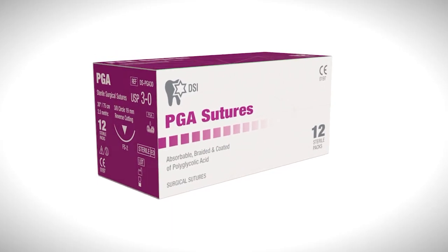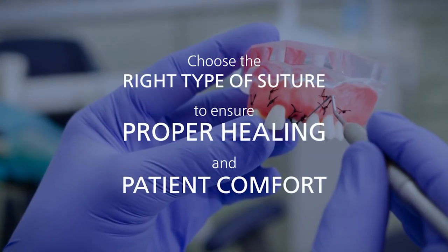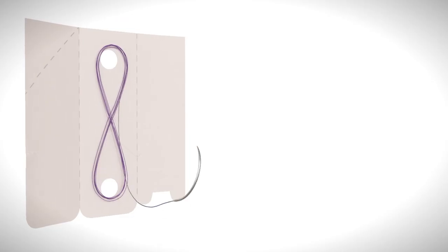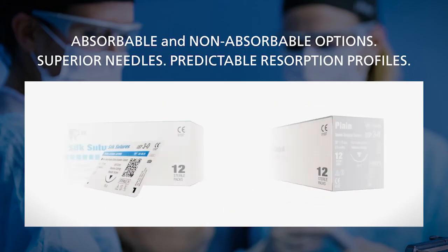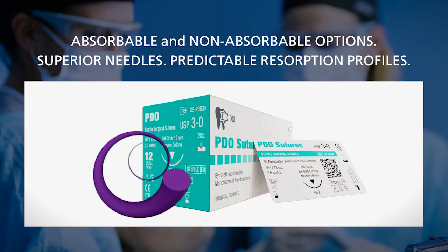In conclusion, choosing the right type of suture is crucial in ensuring proper healing and patient comfort in dental surgical procedures. DSI offers a wide range of sutures designed to meet the specific needs of dental surgery, including absorbable and non-absorbable options with superior needles and predictable resorption profiles.